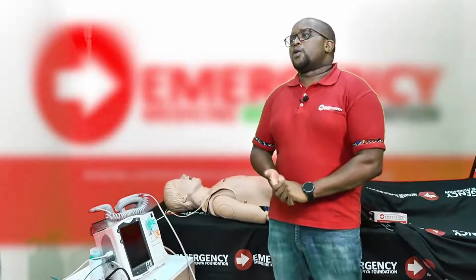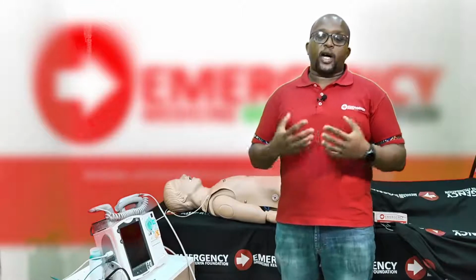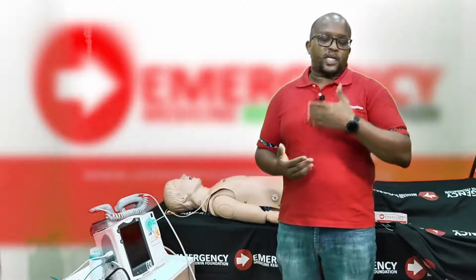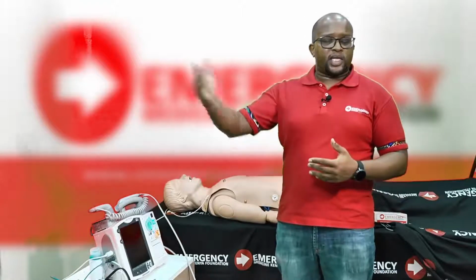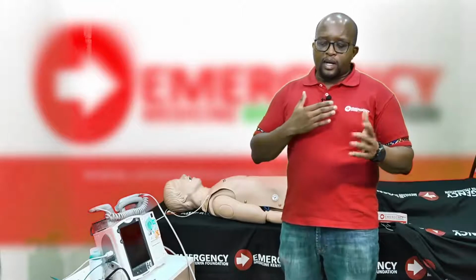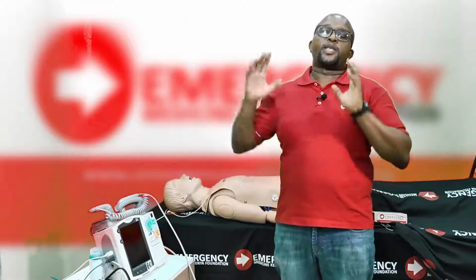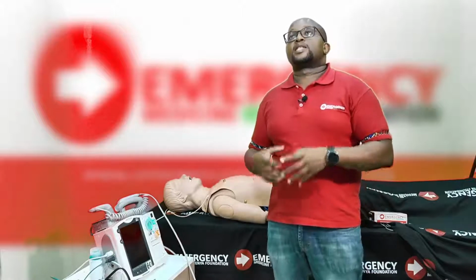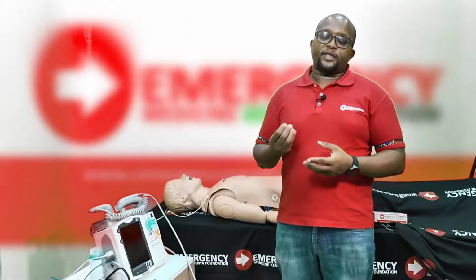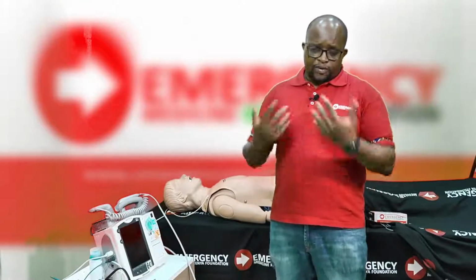Now, the purpose of cardioversion is in a situation where your heart is beating too fast. Too fast, we normally say above 150. In pediatrics, normally say above 180. So this could be monomorphic ventricular tachycardia or just any rhythm that's beating really fast. And because of the speed at which your heart is beating, it's not allowing enough time for your heart to fill up with blood, and thus your patient will present with features of shock.